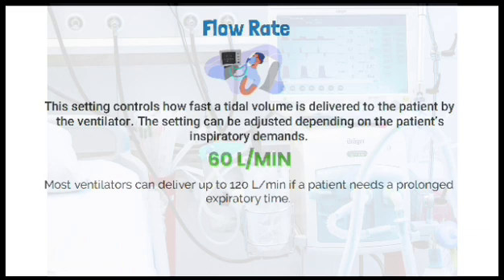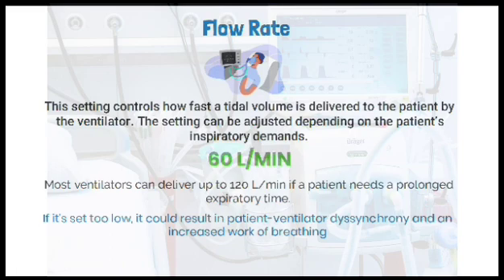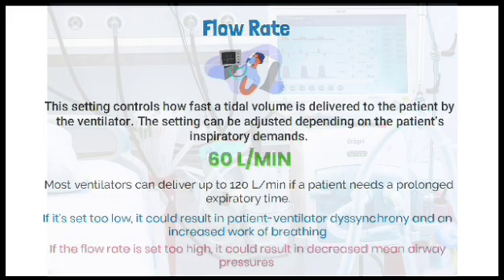When it comes to flow rate, one thing to remember is that if it's set too low, it could result in patient-ventilator dyssynchrony and an increased work of breathing. If the flow rate is set too high, it could result in decreased mean airway pressures.